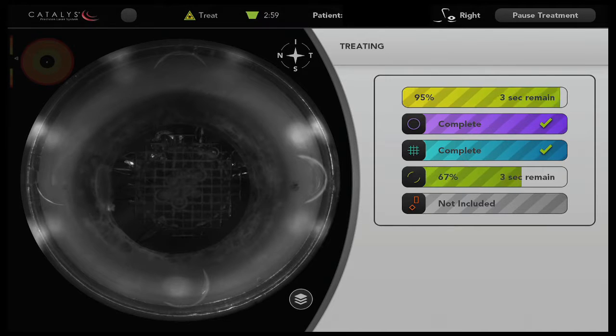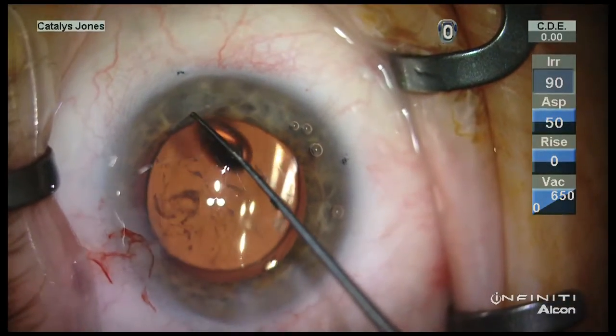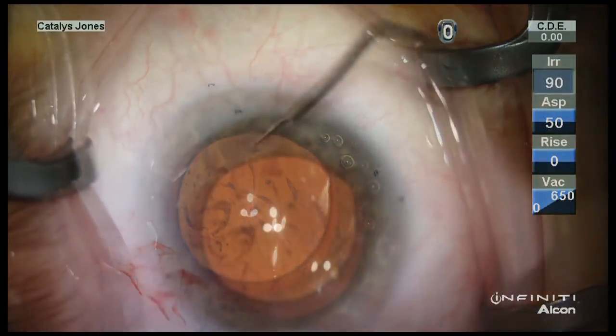Also in this case, this arcuate cut here is 38 degrees, which there's no way that I can produce this specific length of cut with a manual LRI.